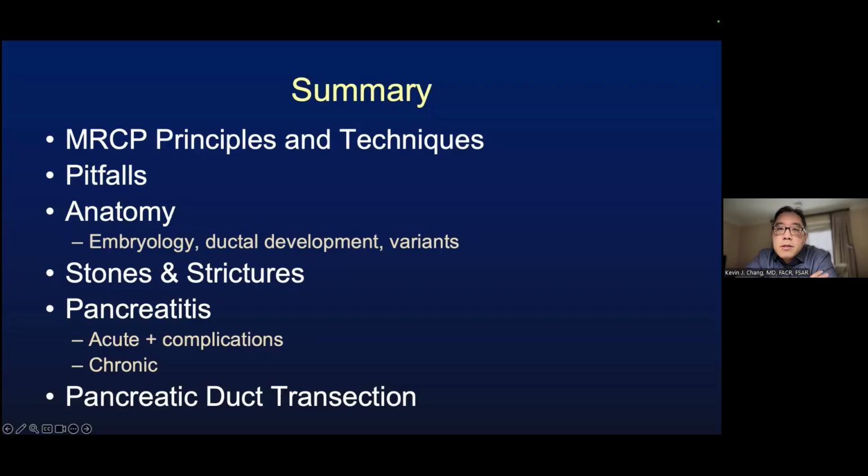All right, and then another last minute question here is important sequences for complicated pancreatitis, or yeah, I'm going to interpret that as complex pancreatitis. So you want to look at all the pulse sequences. I'm assuming by complicated pancreatitis, you mean necrotizing pancreatitis or pancreatitis with adjacent fluid collections. Basically, I look at the T2 weighted images for fluid collections, looking for organized fluid collections, especially the presence of pseudocysts or walled off necrosis.